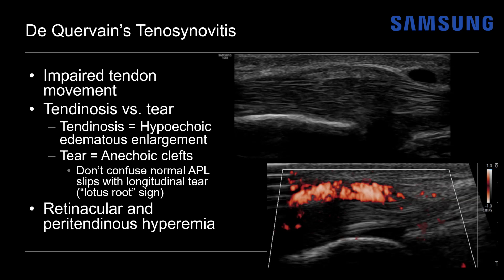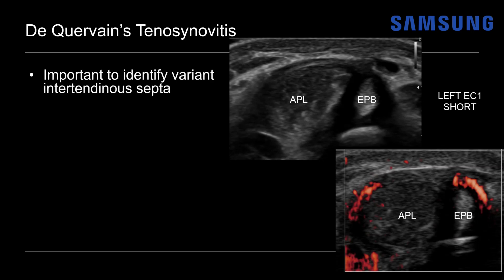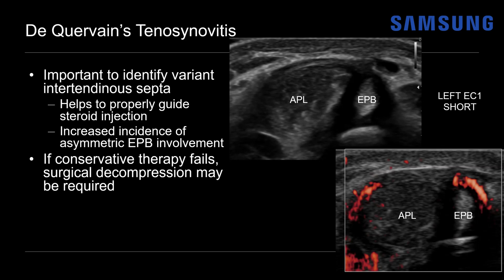An important finding to identify on short axis is the presence of intertendinous septa. Here the APL is heterogeneous and hypoechoic with tendinosis, and the EPB has asymmetric fluid surrounding it because of an intertendinous septum between the two. As disease progresses, we may see retinacular and peritendinous hyperemia. Identifying the septum is clinically important because it can guide steroid injection — if only one side of the sheath is injected, the other tendon won't benefit from therapy. Patients with a septum also have increased incidence of asymmetric tendon involvement, often the EPB, and more commonly require surgical decompression of the retinaculum if conservative therapy fails. This patient did require surgical decompression, confirmed at surgery.